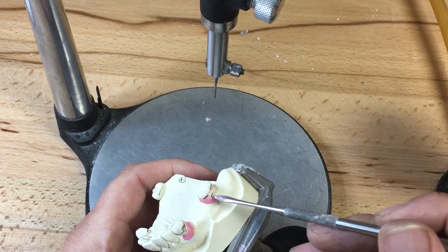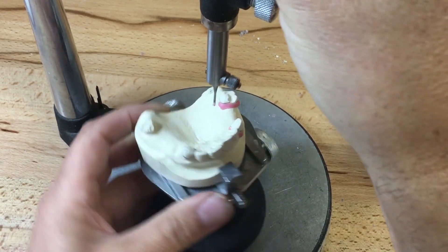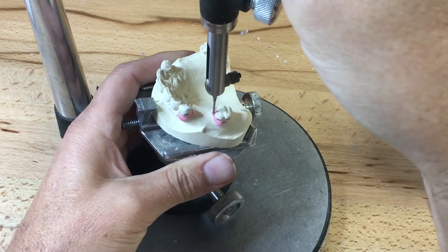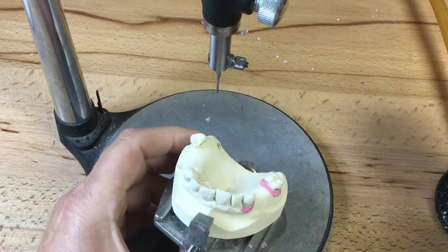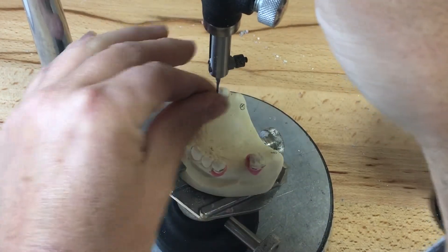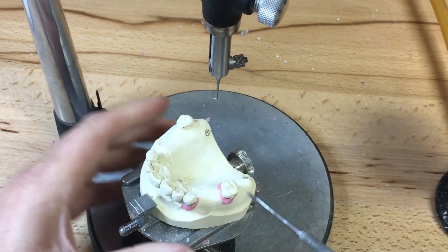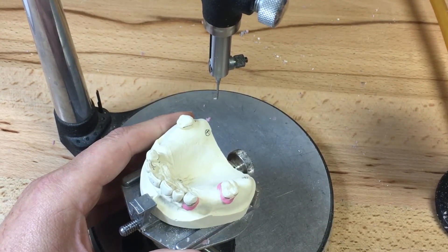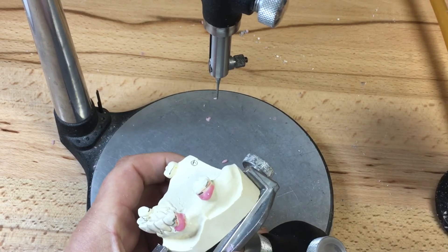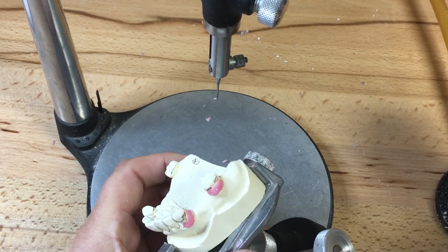I'm going to ledge the buccal arm of the Akers clasp while the wax is still slightly molten, and remove any excess off the guide surface on the molar. Now keep in mind this ledge I'm waxing for my reciprocal and/or retentive arms — I don't want the ledge to go beyond the point angle of the abutment tooth into the guide surface area. I don't want a ledge in my guide plane; I want that nice and smooth, all four of them parallel to the path of insertion, highly polished. So I'll start my ledge beyond the point angle.